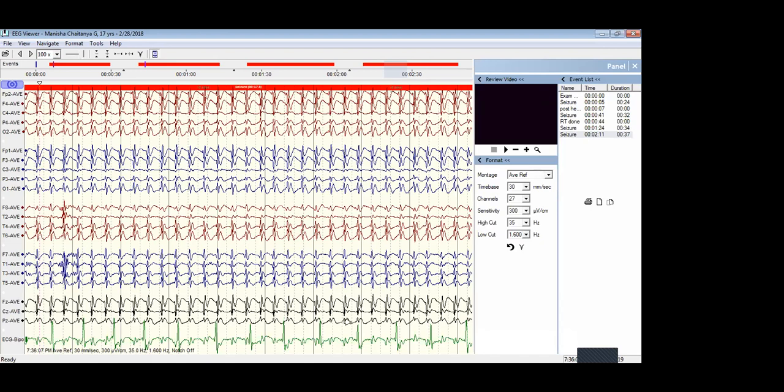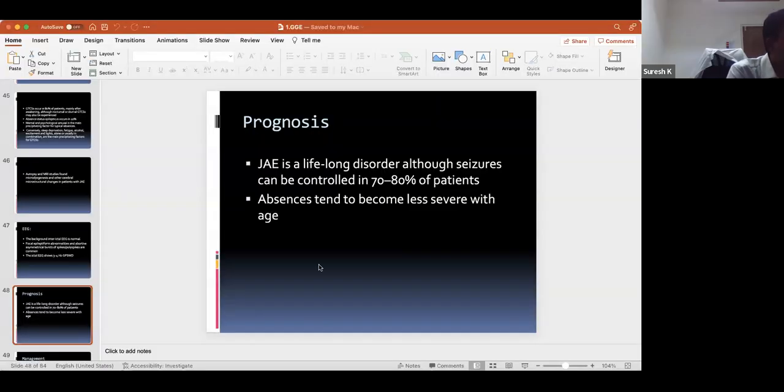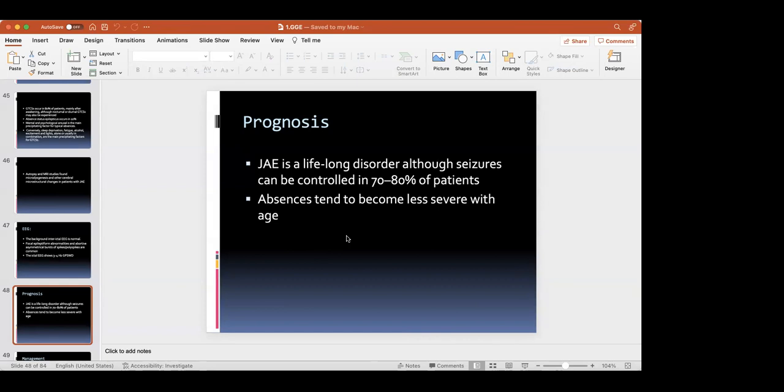Can you share that one? Okay, one second. Here we can see.